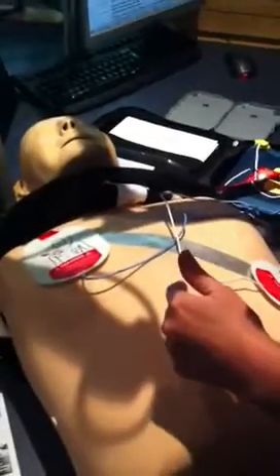Shock delivered. Be sure the ambulance service has been called. So that shock has been delivered. It's safe to touch the patient. It's as simple as that. And start CPR.